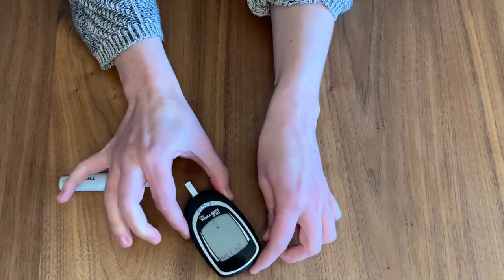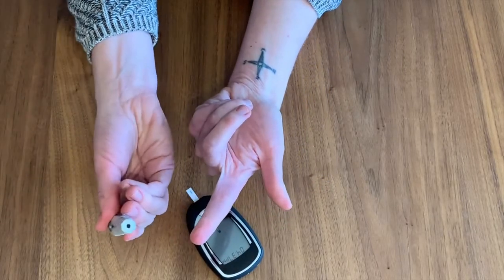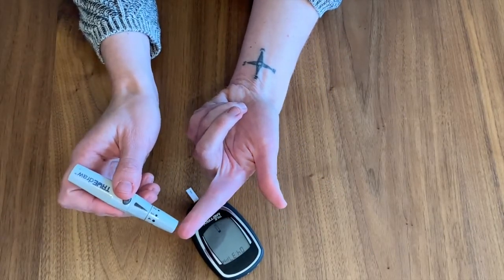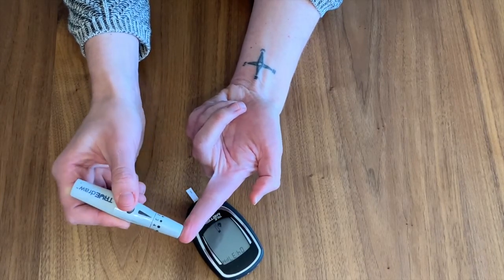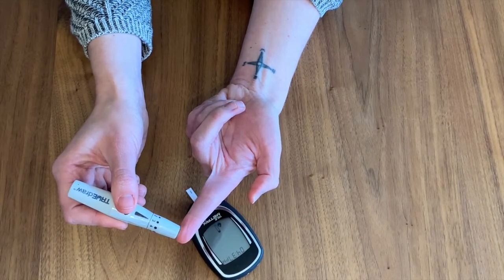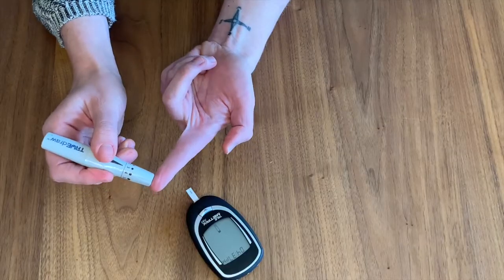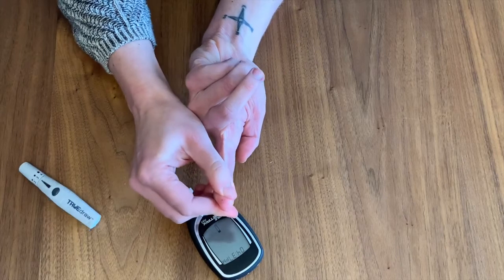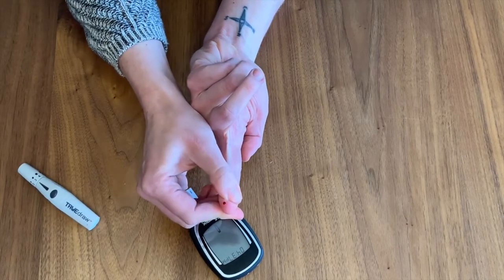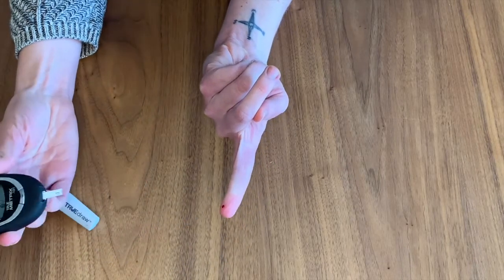Now, take your lancing device and lightly press the end of the lancing device, where there is a small opening, against your fingertip. The best place to poke is on the side of your fingertip or the top. Avoid the center of the pad, as it can be more sensitive. After you poke, gently squeeze your finger to produce a drop of blood. Use a squeeze-release, squeeze-release technique until a drop is produced that is big enough for your machine to accept.